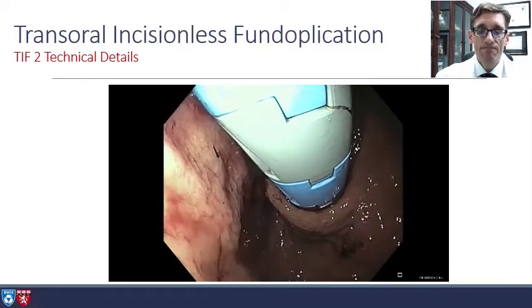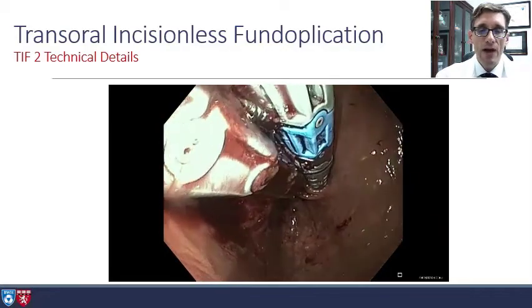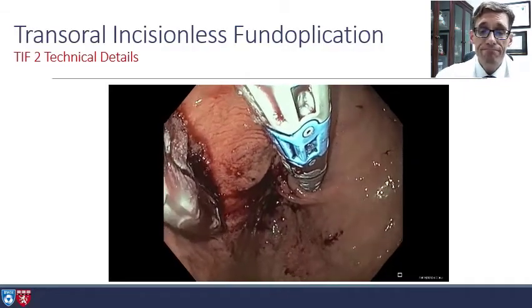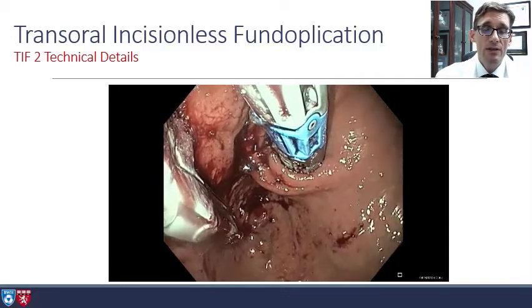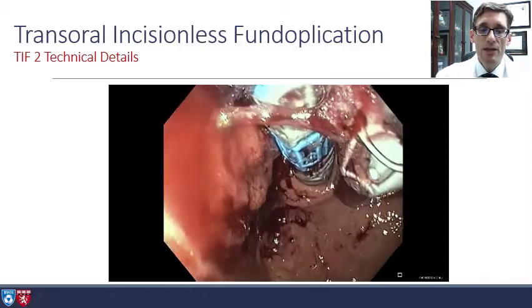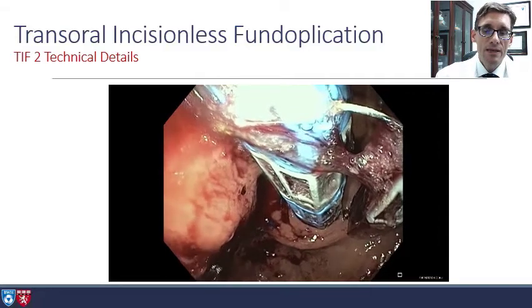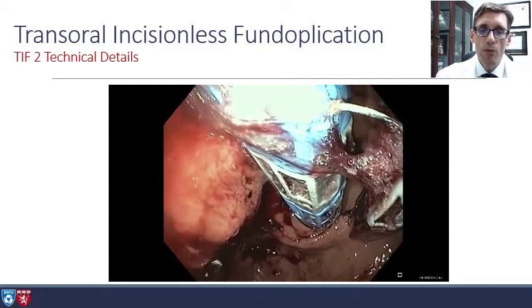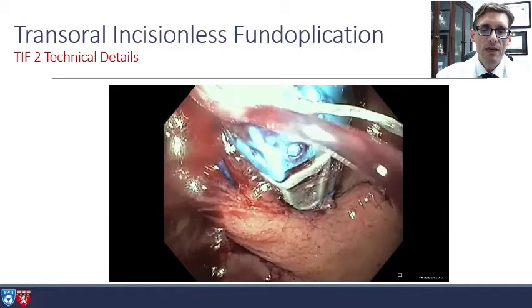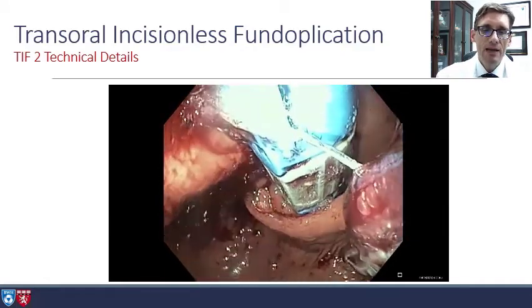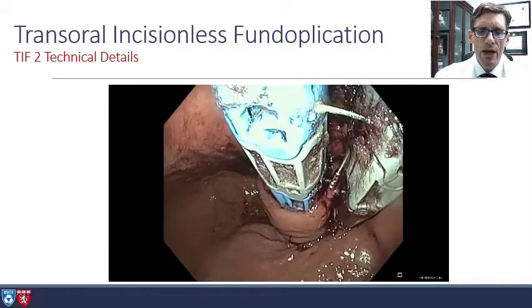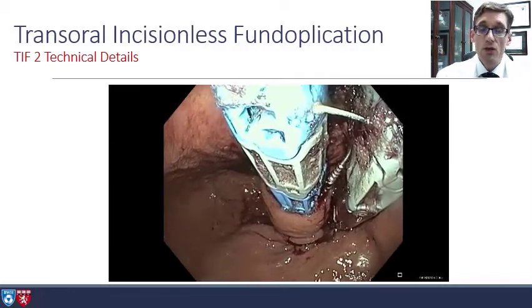You rotate towards the lesser curve regardless of which side you're on. Then you fire those H fasteners, unscrew the helix, and open the jaws. You repeat this several times at each station. Then you rotate over to the other side and repeat the process, placing that helix into the tissue right around the Z line. You acquire the tissue, open the jaws to see where that is, and pull the tissue deeply into the device above the blue line. You close the jaws partially, rotate — this is an important rotational element — then tightly close the jaws and fire the H fasteners.